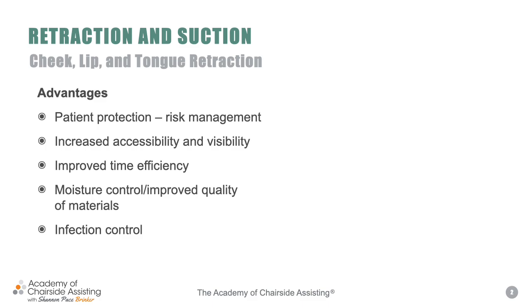We also want to make sure that we understand that our main role as a dental assistant is to keep, again, that visible, accessible, and comfortable area for the patient, but most importantly, to provide a very organized and efficient operating zone for the doctor. We want to make sure that the fluids do not interfere with any applications of dental materials, and we know in dentistry how important it is to keep the saliva away from the working field. There are no fluids or materials for the patient to swallow or, most importantly, aspirate, and no interferences with the manipulation of any handpieces or instruments being utilized by the operator.